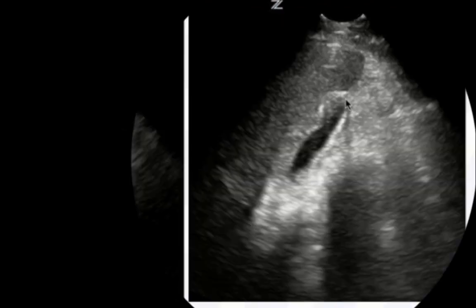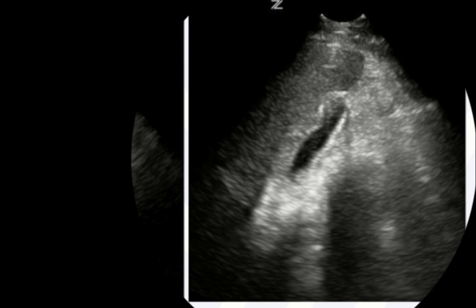Here we see a gallbladder where the wall is no longer well-defined — all of this is wall and it's thickened. This is somebody with an inflammatory condition. Most of the time this is representative of acalculous cholecystitis, though occasionally you may see similar findings in patients with acute hepatitis. You may also see a thickened wall in calculous cholecystitis, but in this case there are no stones.